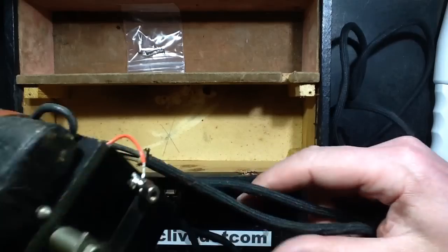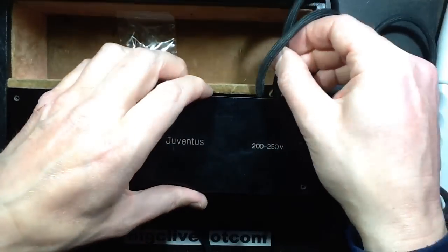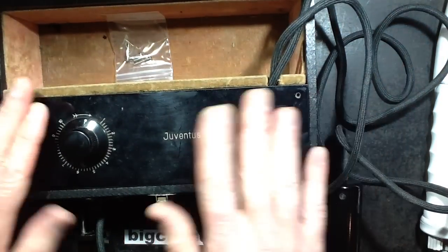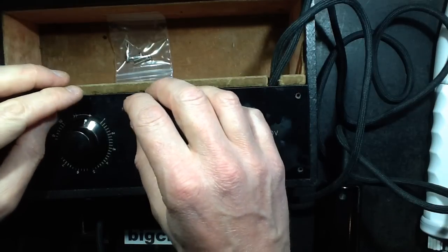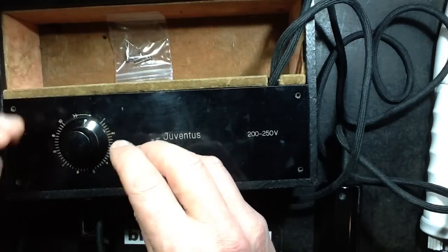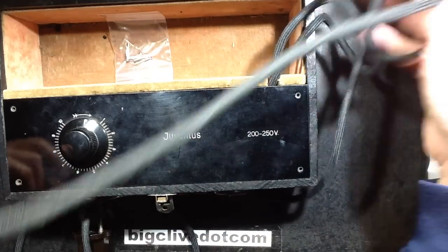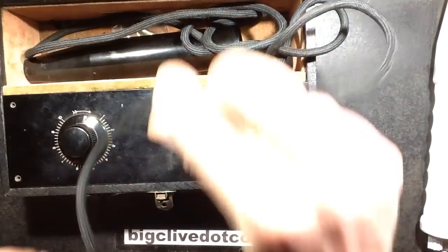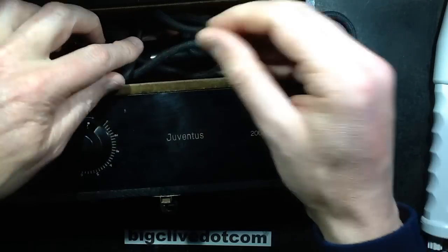So that's the science behind the old original mechanical ones. All very stylish, and slightly deadly. I was going to say this is a safer looking one. I've seen other ones that have just mains wires going straight onto open metalwork of bare brass electrical connections and knobs. Back in the old days when electricity was new, nobody really considered electrocution much. So I'll put that down and go back onto the modern electronic unit. Let me stuff this all in and carefully hinge the lid down so I don't damage the last remaining electrode in that set.